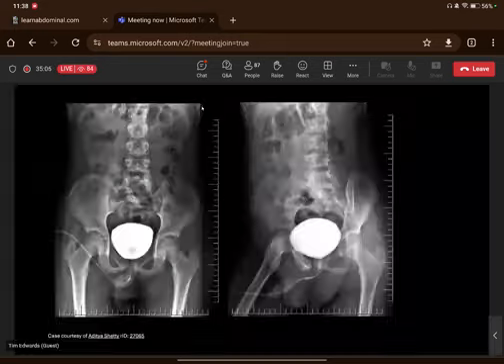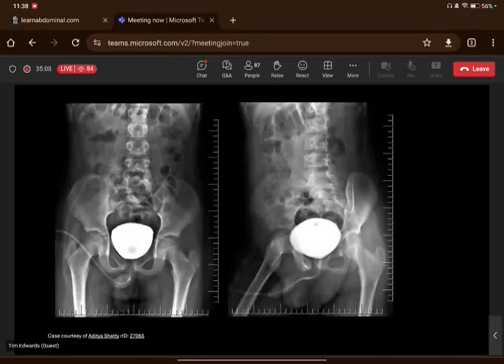So I've included here a micturating cystourethrogram. It's quite a common study done in the pediatric population, and what happens is the patient is catheterized under fluoroscopic guidance. They have their bladder filled with contrast, as you can see here. This is the bladder filled with contrast on the AP image.